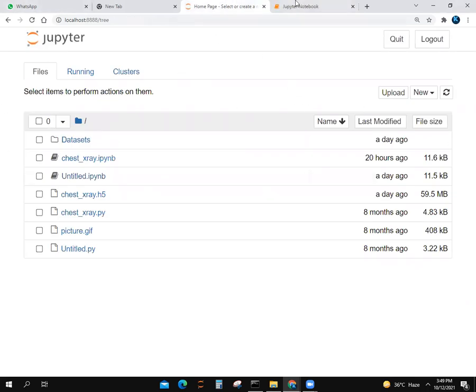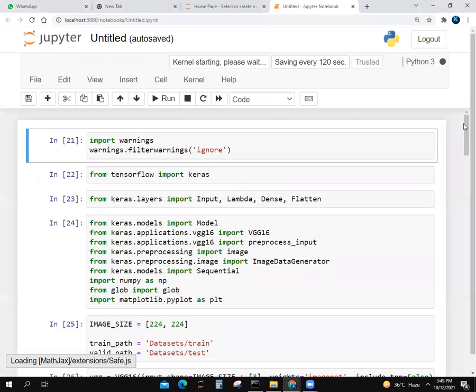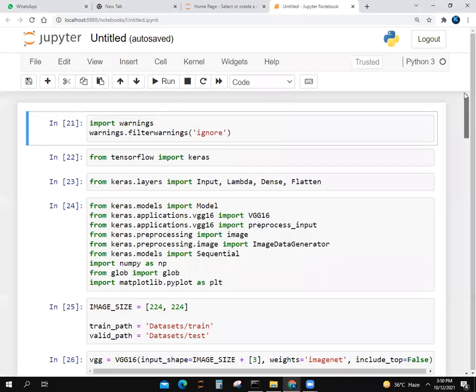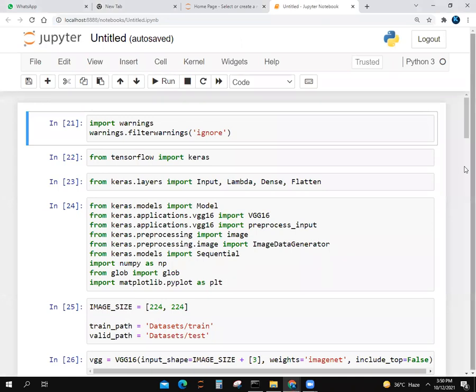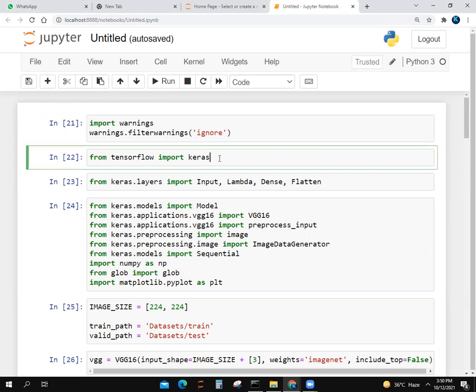The program predicts whether you have pneumonia or not. We give an x-ray report to the program and the program will tell us if we have pneumonia. I have imported warnings here. After that, I write warnings.filterwarnings and ignore in inverted commas. Then from TensorFlow import Keras.